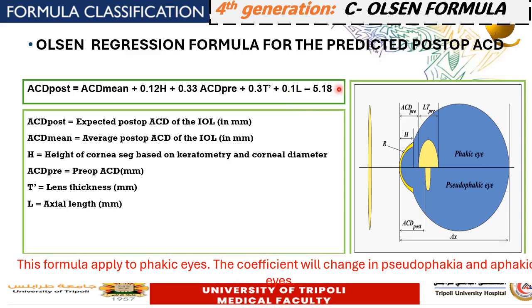You need not memorize this equation, but understand that Dr. Olsen's presumption is not related to the axial length too much and is not related to the K reading exactly. It is mainly dependent on the AC depth and related to the lens thickness, as you can see. They applied this equation retrospectively and established a regression analysis for a series of data, and accordingly we can mathematically predict the physical location of the implant within the capsular bag.